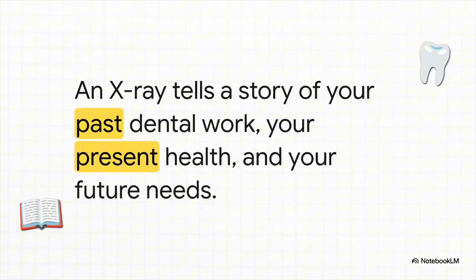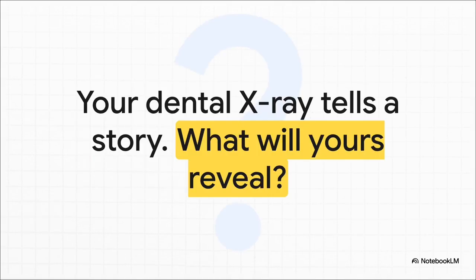So, when you put it all together, a dental X-ray is so much more than just a picture. It's a history book, telling the story of all your past dental work. It's a diagnostic snapshot of your present health, and it's kind of like a crystal ball, helping your dentist see into the future to stop problems before they even start. It's a whole story, told in nothing but shades of black, white, and gray.